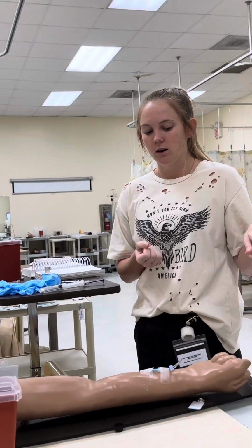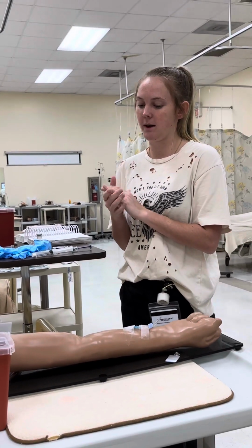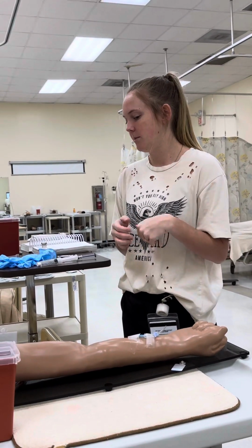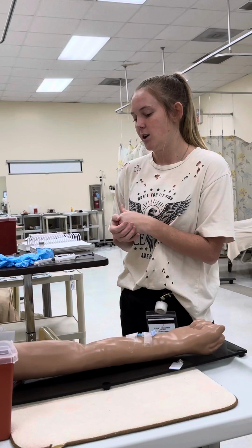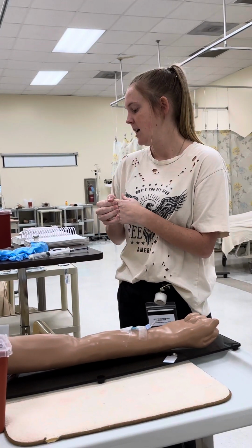I'll knock. Hi, my name is Maddie. I'm going to be your student nurse today, and I'm going to be giving you your IV medications. I'm going to provide the patient with privacy. Can you state your name and date of birth for me? Patient states their name and date of birth.